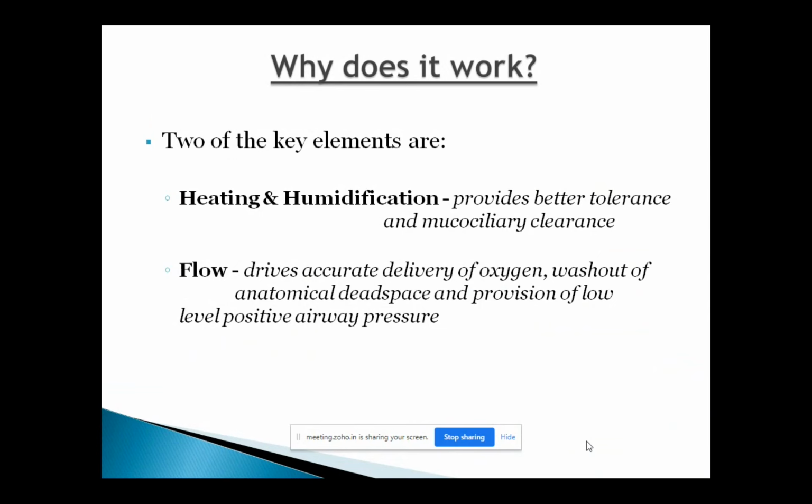So you exceed the demand by pushing a lot of air into the nose, but remember, I'm talking only about the flow of air here. Imagine you go in a car and put the window down, and you feel the fresh air coming and hitting your face. It's exactly the same feeling, the air literally sitting in the patient's nose for them to breathe in. By exceeding their inspiratory demand, you're making their breathing a lot easier.